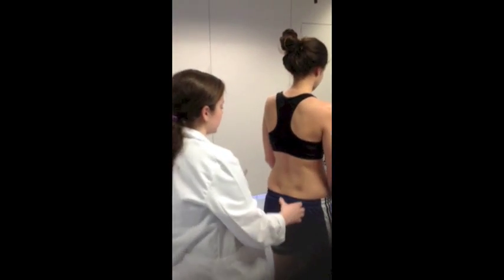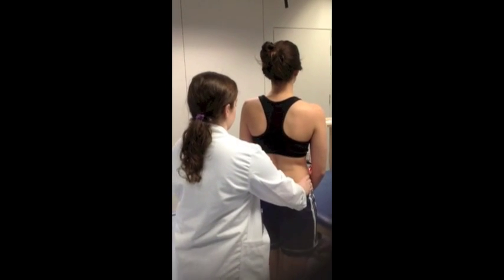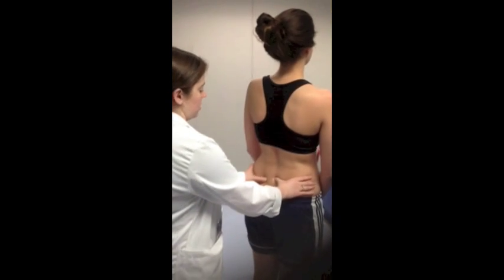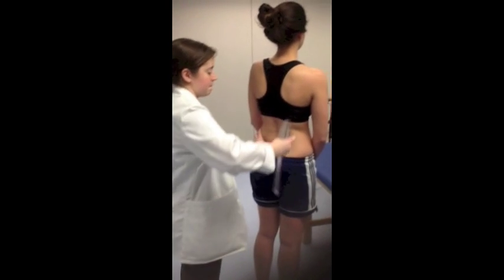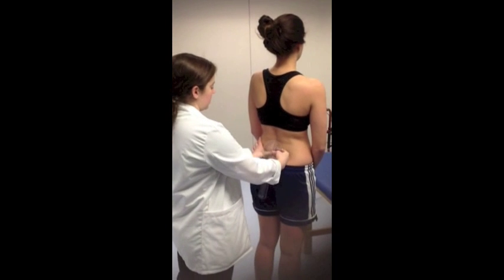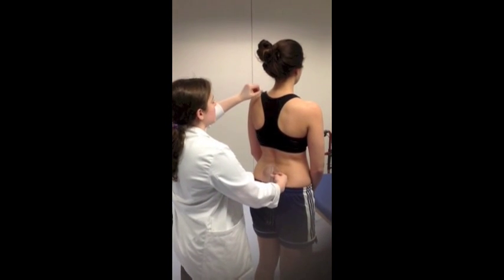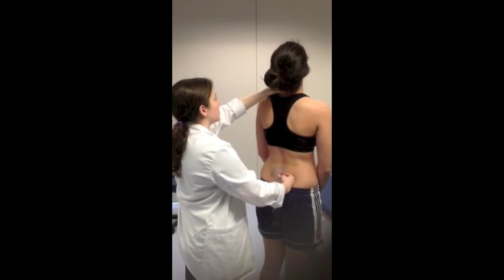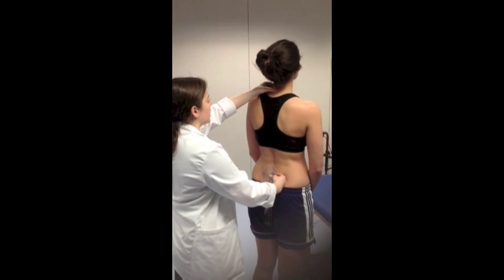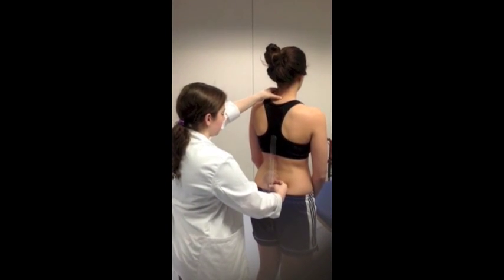And then I'm just going to feel around your low back for your first sacral vertebra. And that's where the middle of my goniometer is going to go. The stationary arm will be pointed at the floor. And then I'm just going to feel around the base of your neck for your 7th cervical vertebra. And then if you could just look up to the ceiling for me so I can confirm. Perfect. You can put your head back at neutral. Alright, and that's where my movable arm is going to go.